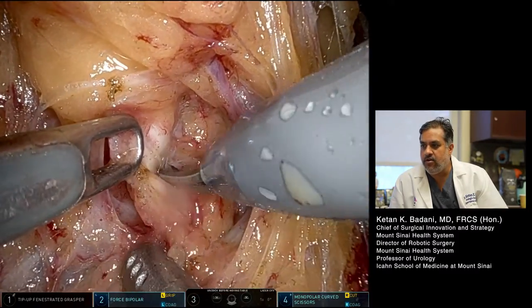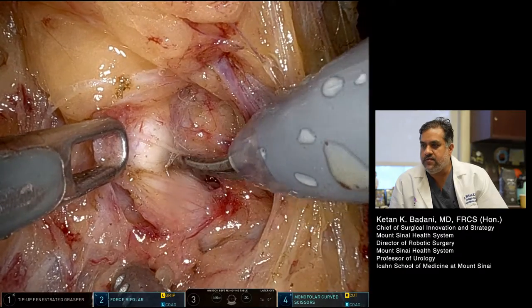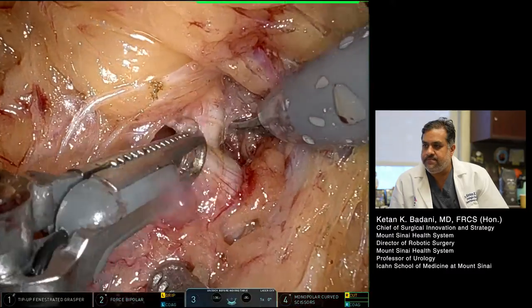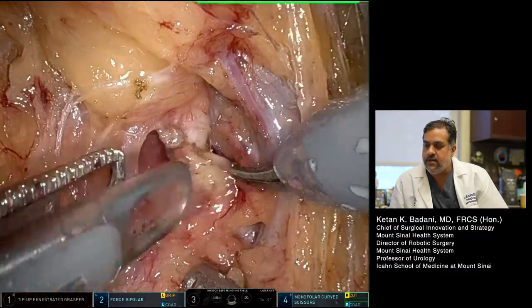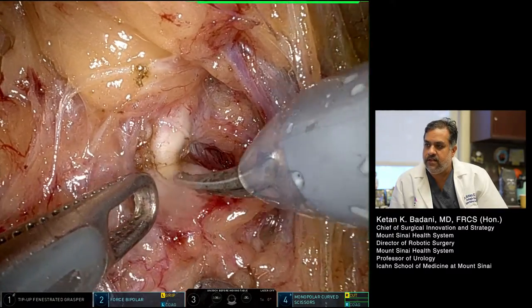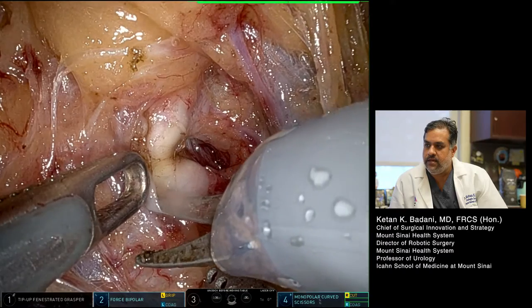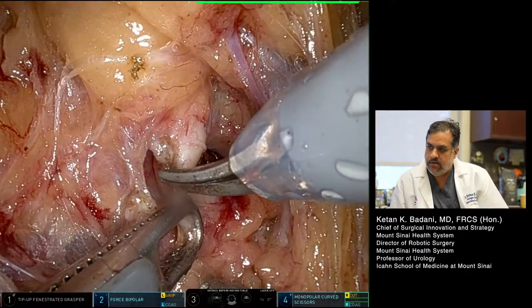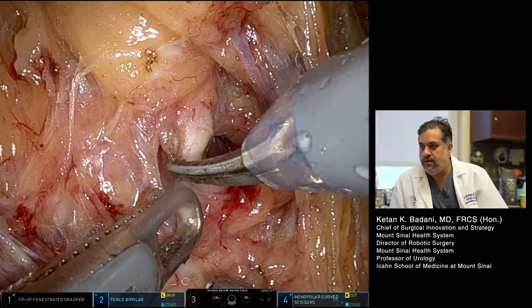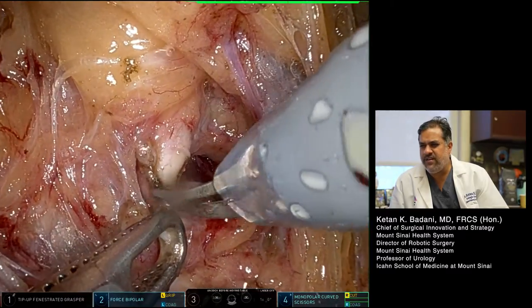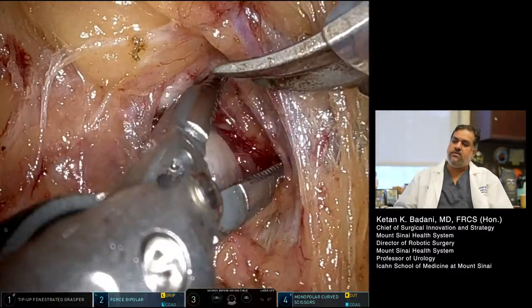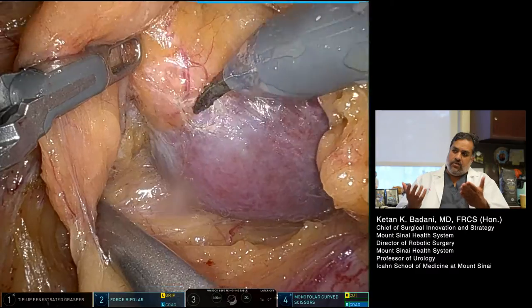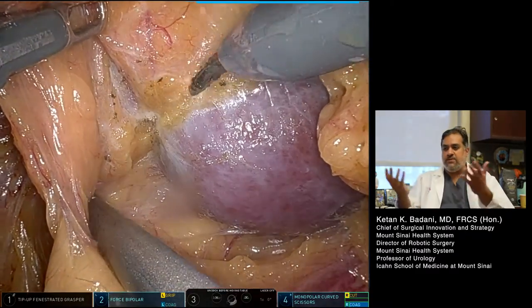I have both sides of the artery — there's the far side, here's the close side. I'm cleaning off a little bit so that when I put these bulldog clamps in they'll effectively occlude this artery. These are lymphatic branches, but many times they're vascular, so I take my time. I like a clean field, and you can do this even in a redo setting. You see some scarring around the renal artery — a little more than usual because it's been dissected before.